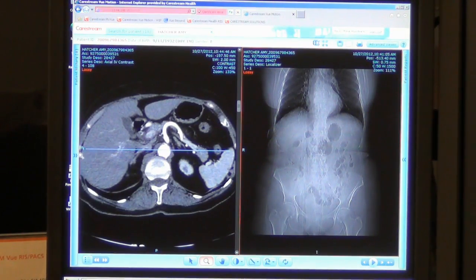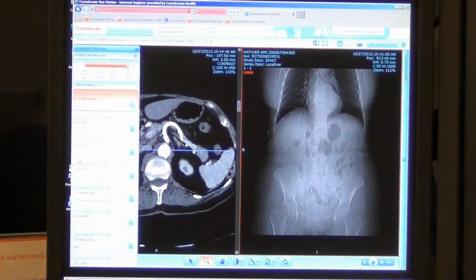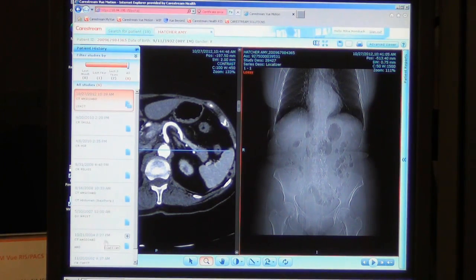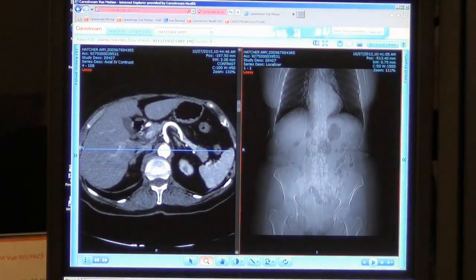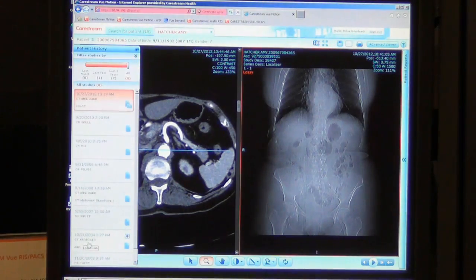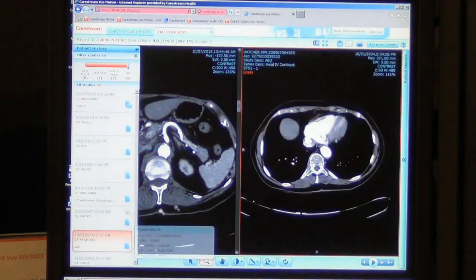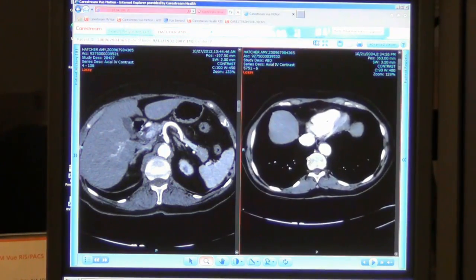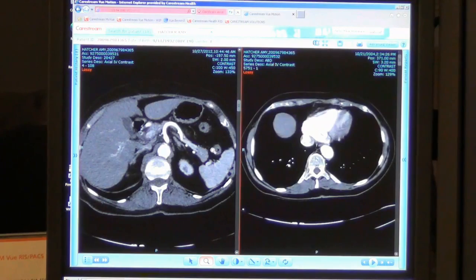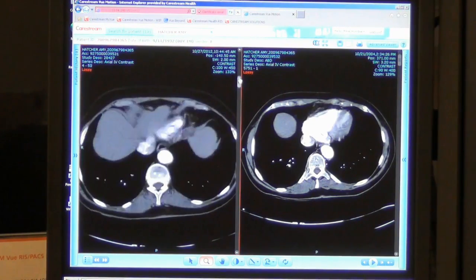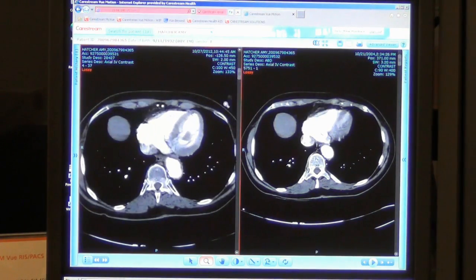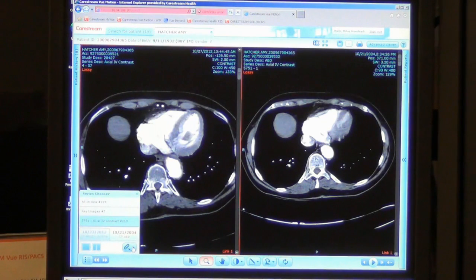Over on the left side of the screen, I have a panel with prior exams. So I may choose to, instead of the localizer, put a prior side by side. Now if I line up these slices, I can also come back to the series selector and link these studies together so that they scroll through simultaneously.